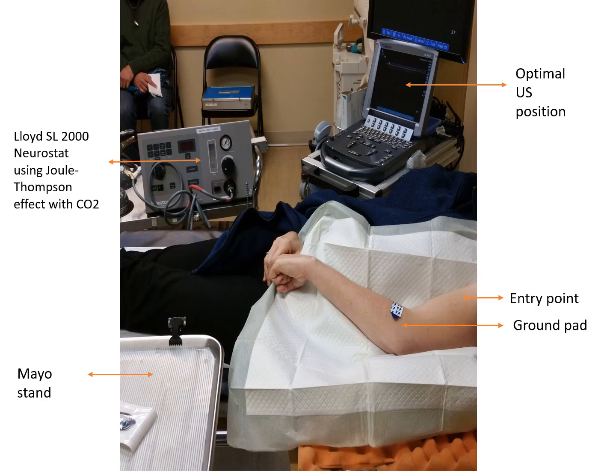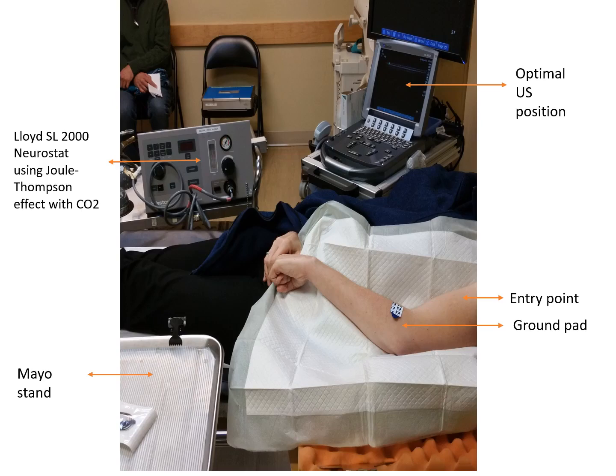The musculocutaneous nerve can be targeted via the classic medial approach; however, with ultrasound guidance it is also possible to place the patient in a more comfortable position and perform a lateral approach, as seen at the entry point here. As with all diagnostic nerve blocks, it is crucial to ensure that the E-stimulation threshold is 0.8 mA or below to confirm proximity to the nerve and avoid overstimulating the muscle fibers themselves.